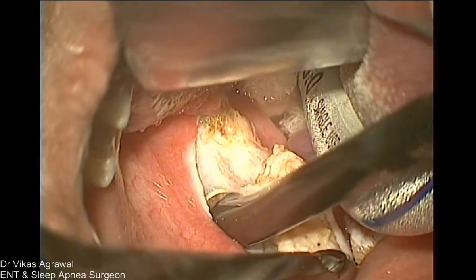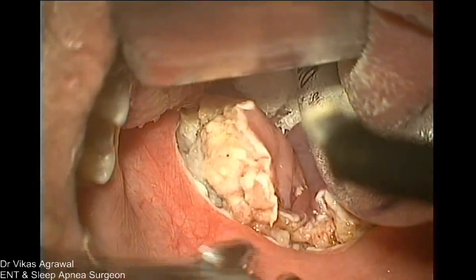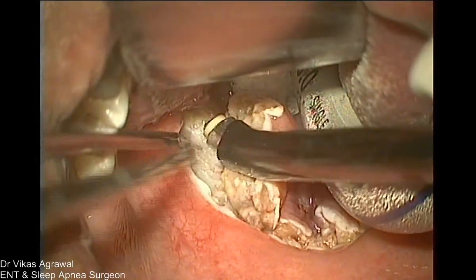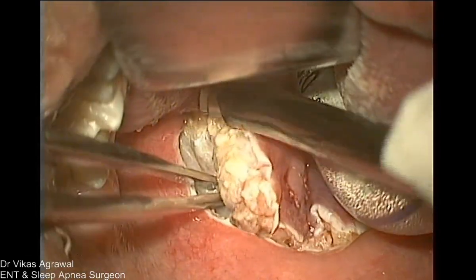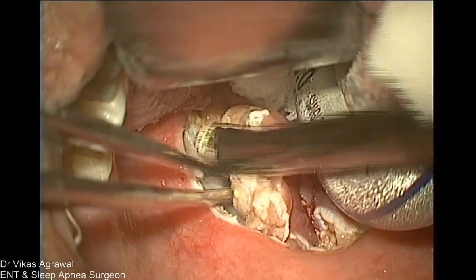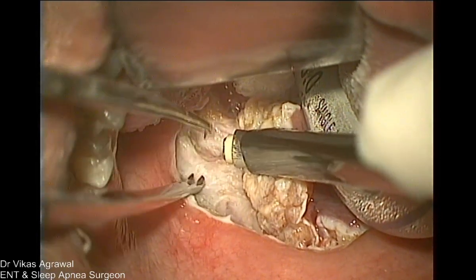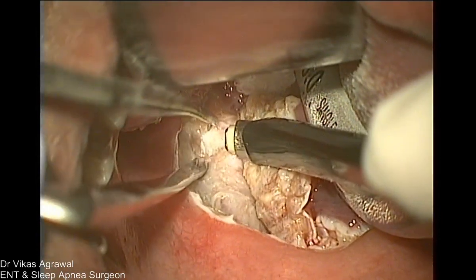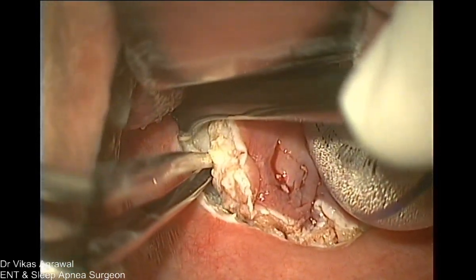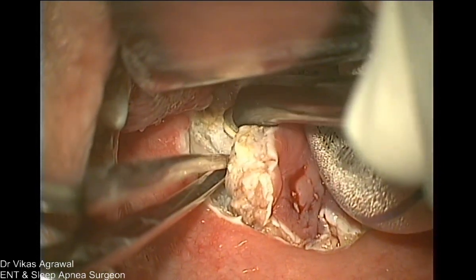So anyway, I have stopped it. If at all you get the tonsillar artery, which I was trying to avoid and unfortunately exposed, what should I do now? The bleeding has stopped, but it can always come back again. What I have done here is only touch the open end of the tonsillar artery, but the back of the artery is still live. So I'll go behind the tonsillar artery and coagulate so that the whole artery is coagulated.